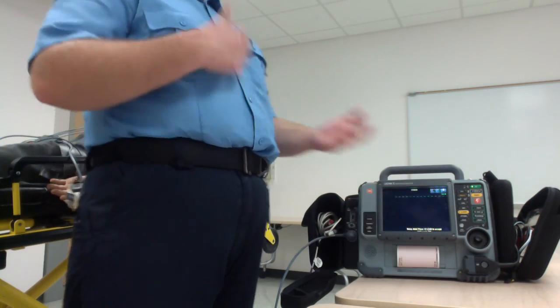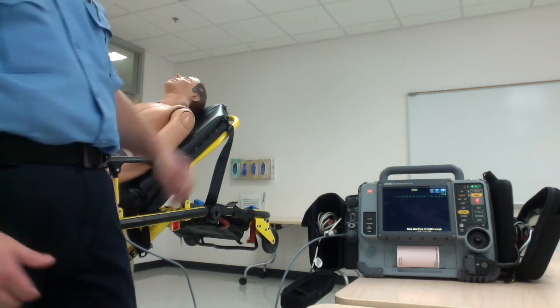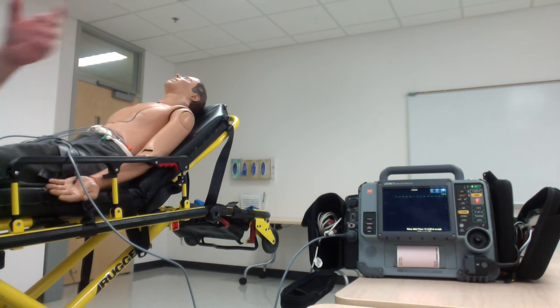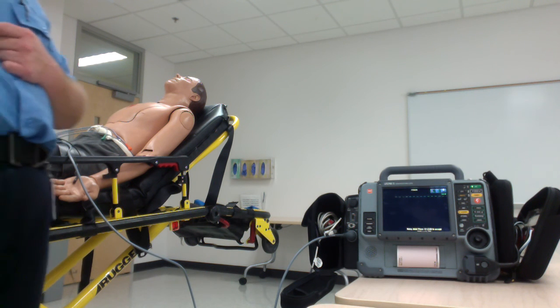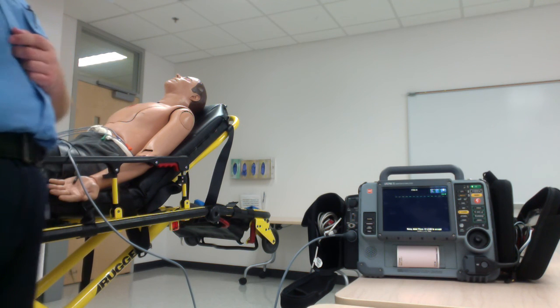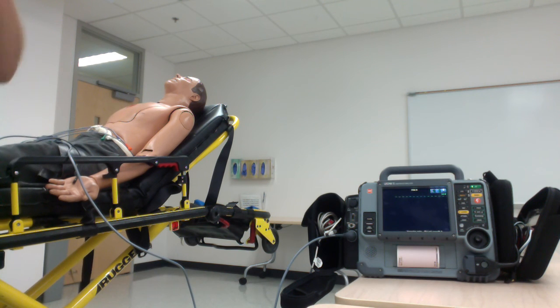Once it prints off your reading, then you can go, like we had in the slide earlier, through reading it and looking: do I see anything out of the norm? What does my little box at the top say? Your results are actually written at the very end, after all your 12 leads have printed off.